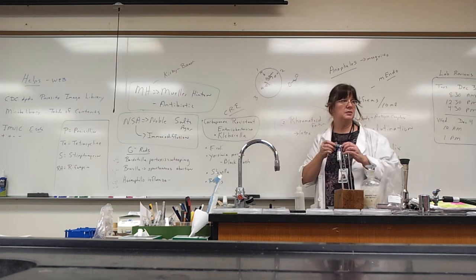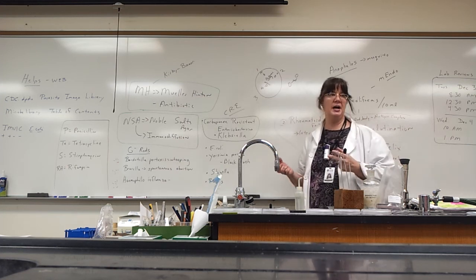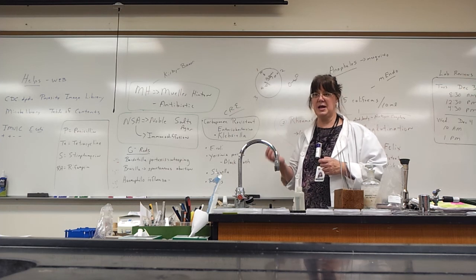And what is the white line called? It's called the line of precipitation. Like we're going to have precipitation tonight when you're going to have rain, snow, or ice. But it means solid. Solid antibody antigen complex.